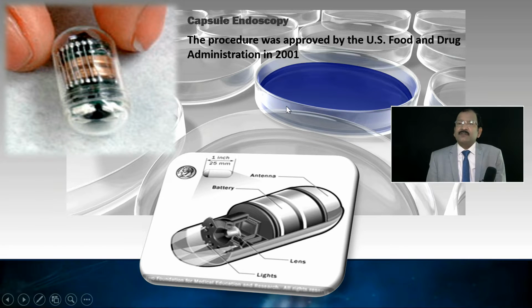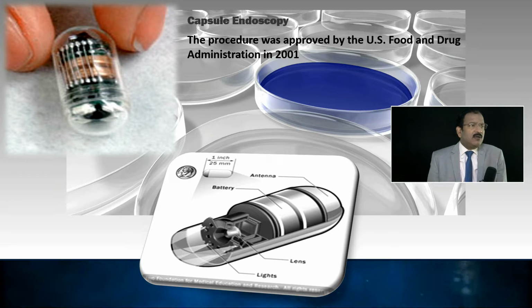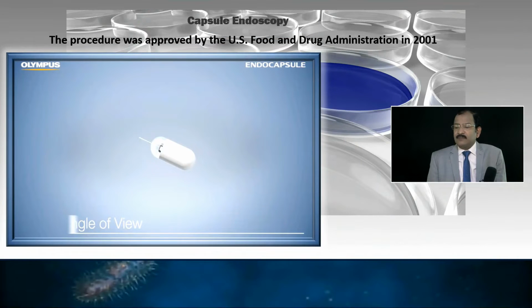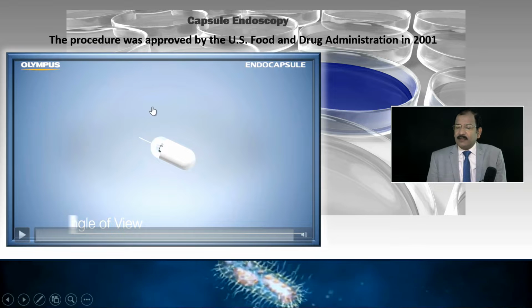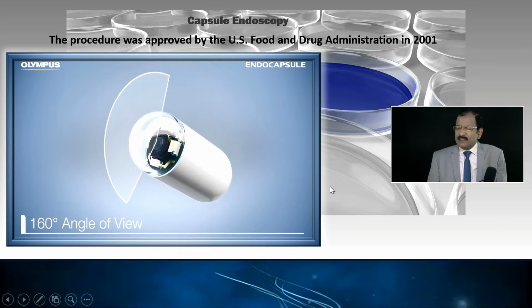When it was introduced, it was thought that it would revolutionize and be so popular that all over the world manual endoscopy would almost stop. But this didn't happen like that. And ultimately, it is a flop. It is only pushed by the company, and there is only a specific indication.